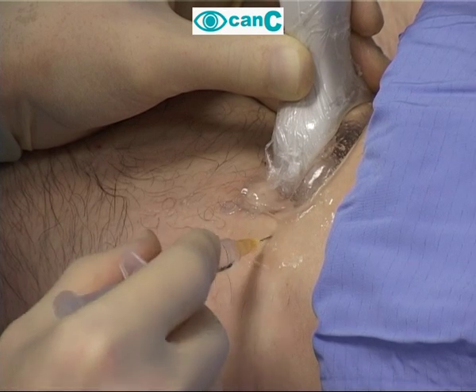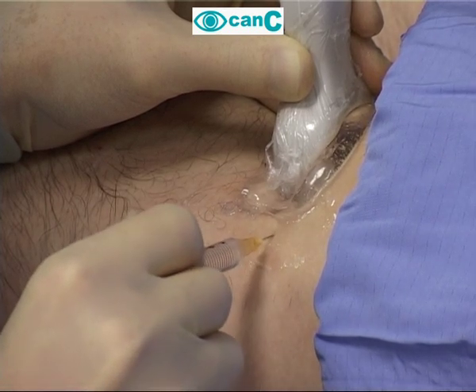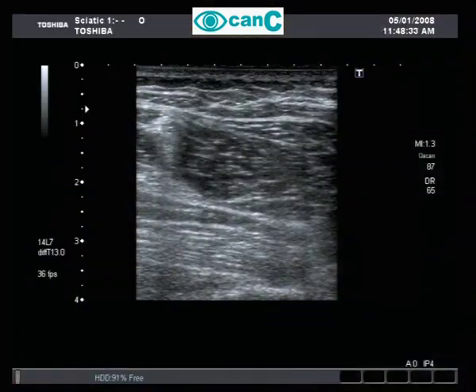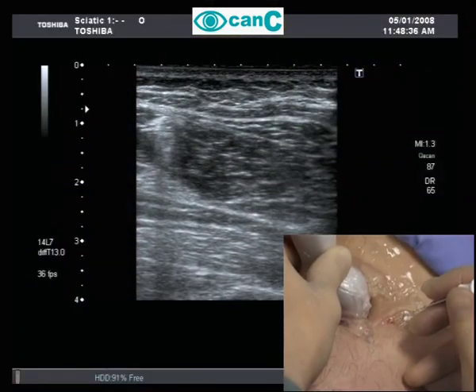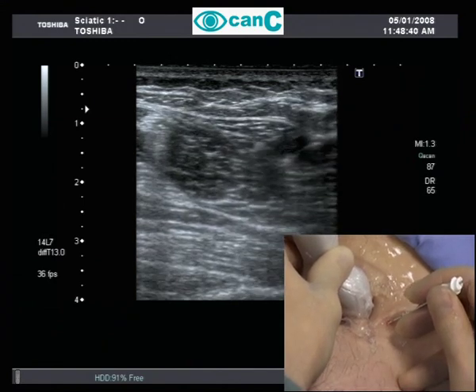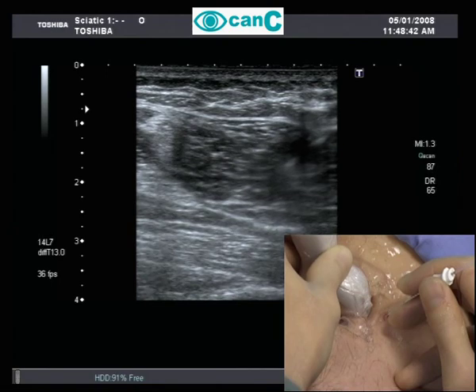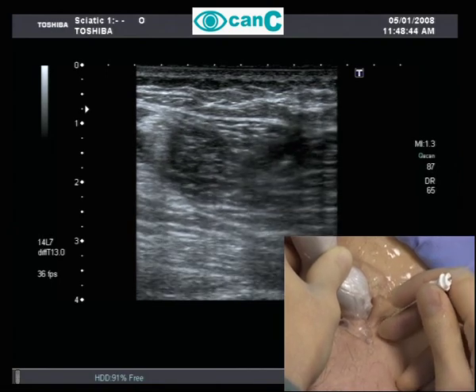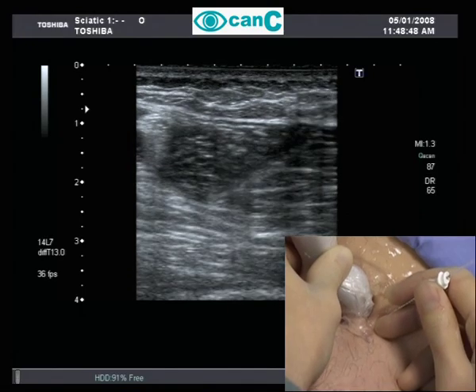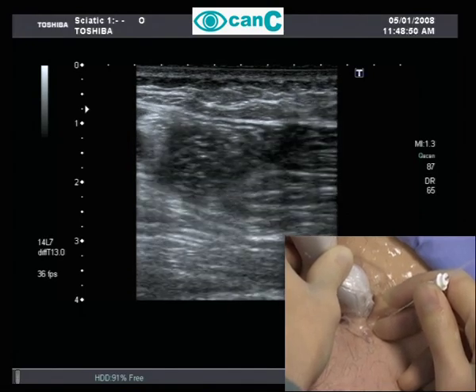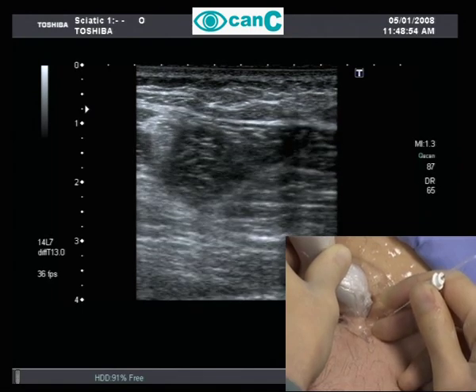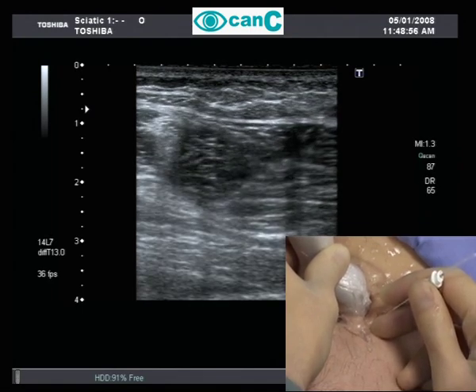Puncture site analgesia is administered. The aim is to place the needle tip into the fascial plane close to the nerve, all the time taking care not to impinge directly on the target.